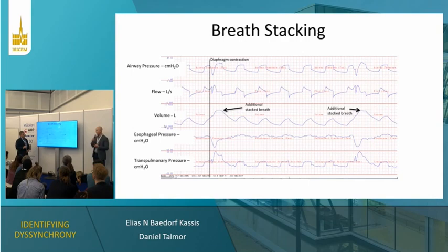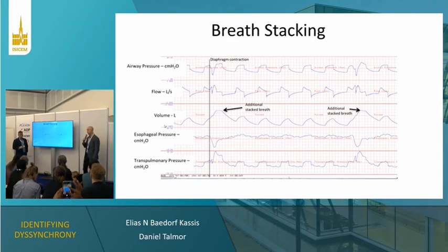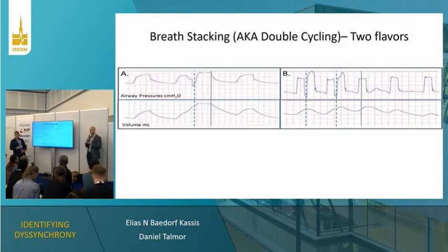Yeah, and on the bottom, in the transpulmonary curve, you can see those pressures get massively higher than what you get with the corresponding passive breaths. These are really large stresses across the lung, which if delivered with enough frequency may really put the patient at risk for overdistension injury in some cases. It's hard to see the scale on those tracings, but it was getting to a transpulmonary pressure of 30. Anything above 12 or 15 is probably injurious. So it was massive pressure directly on the lung.